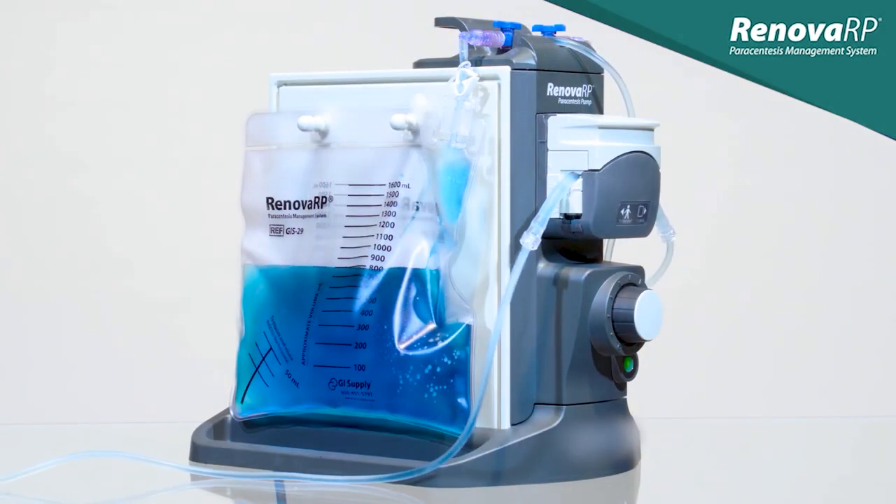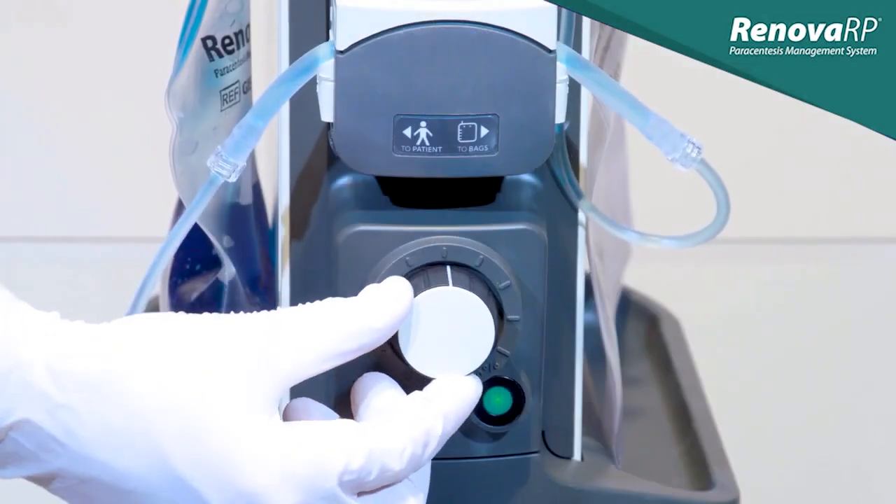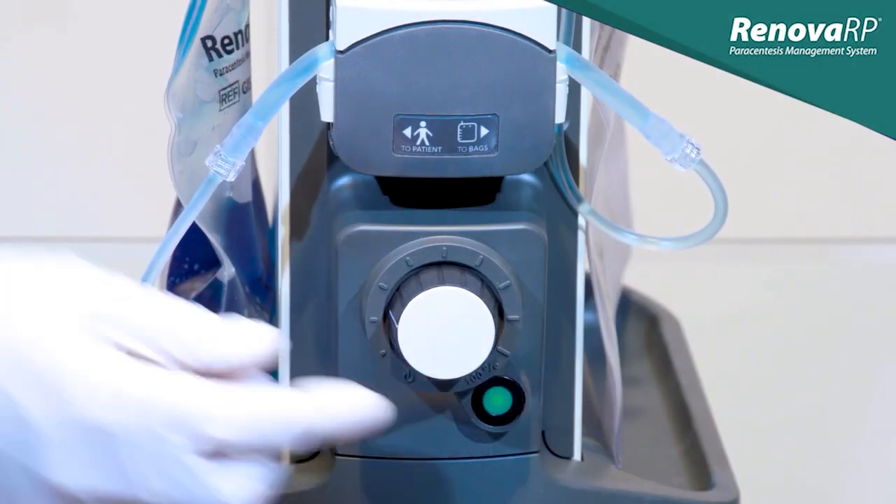To maintain the simplicity of the device, the pump does not have an automatic shut off. If you need to walk away, you can simply slow it down or turn it off.